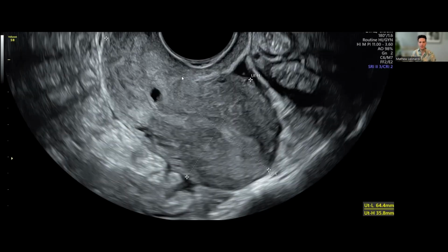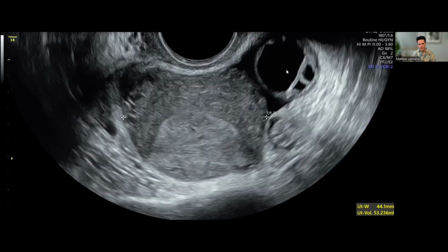All right, I moved on to some other really important standard things that need to happen during a scan. You need to assess the uterus and the ovaries. You need to follow a standardized approach. So that's usually my approach: bowel, have a little glimpse of what's going on, and then capture a lot of my standard things. So our retroverted uterus is normal in size, normal in length, and in its anterior-posterior diameter. It's normal in its width, normal in volume.